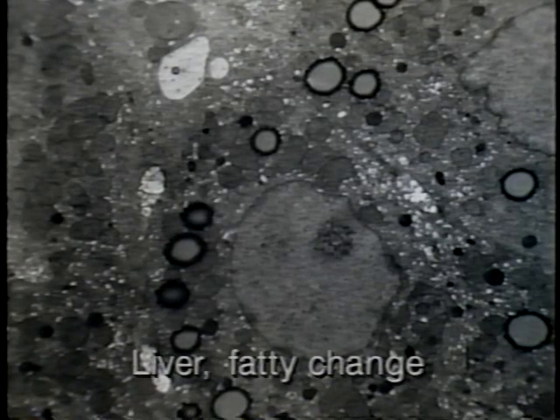Note especially these small membrane-bound structures containing electron-dense droplets. These are liposomes, and the dark droplets are lipoproteins. This represents a very early stage of abnormal lipid accumulation in cells that have been injured by methylmercury. This electron micrograph represents a slightly later stage of lipid accumulation. Here is the nucleus. These structures are neutral lipids, which are not membrane-bound. These lipid droplets are formed by coalescence of liposomes and loss of enveloping membranes. These droplets continue to coalesce until they form the large, clear spaces seen in light microscopy.